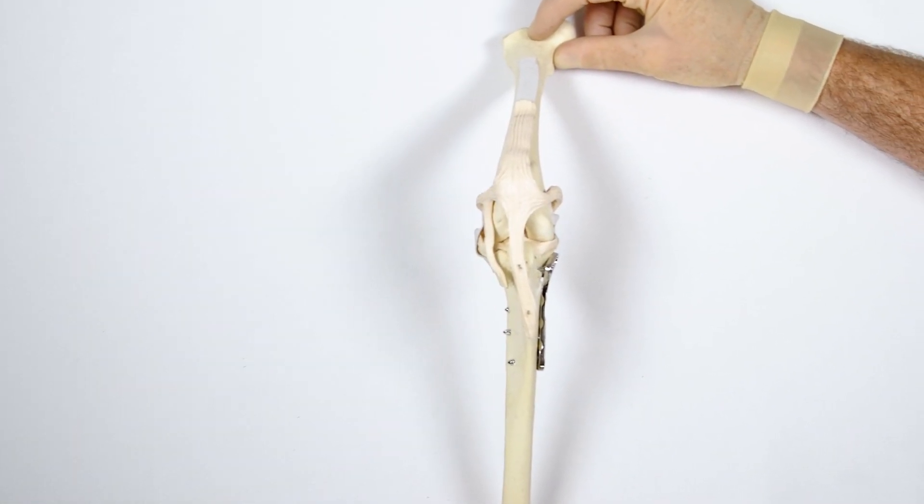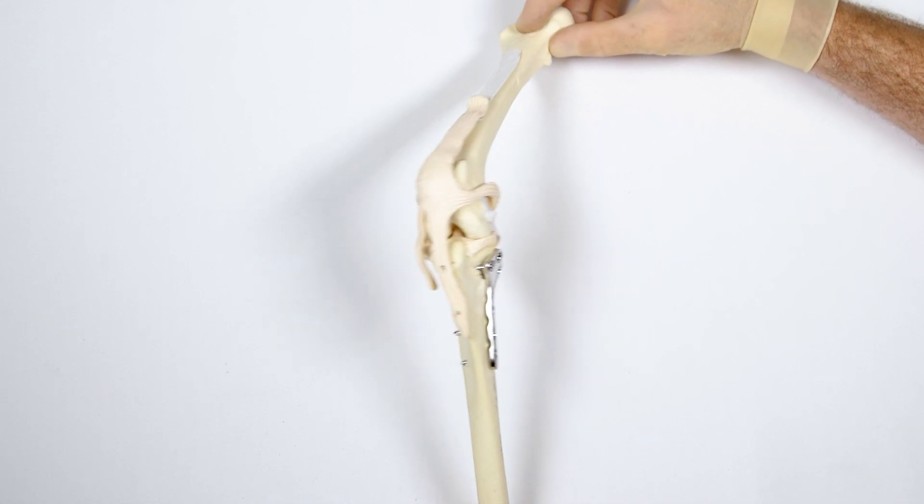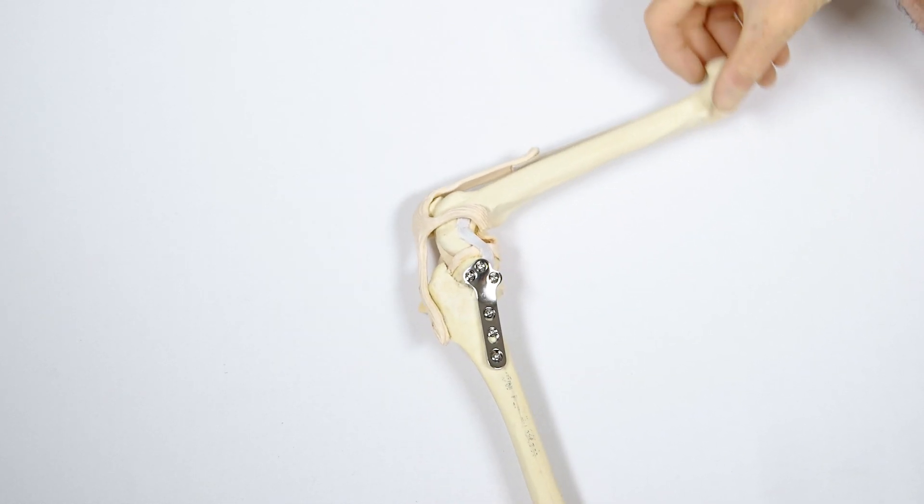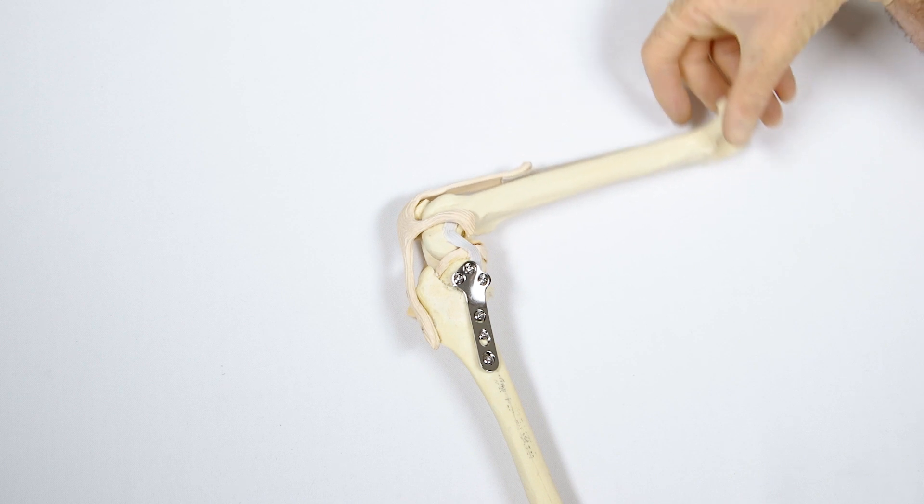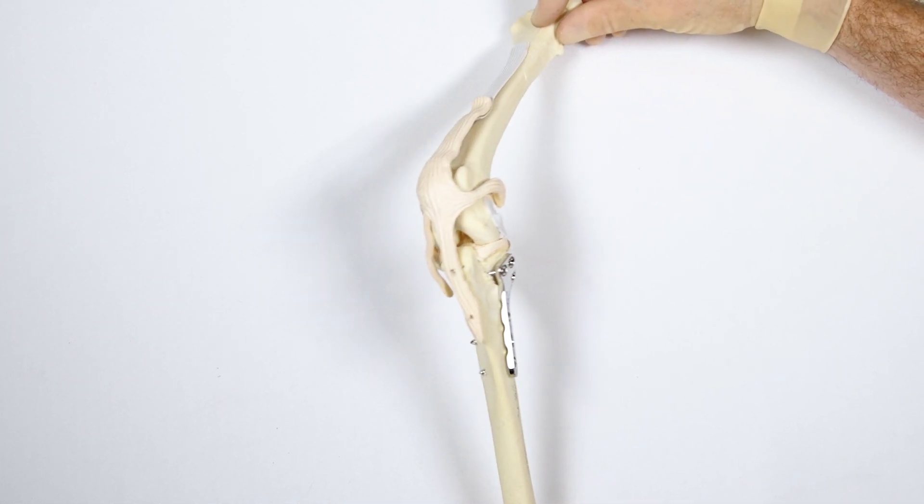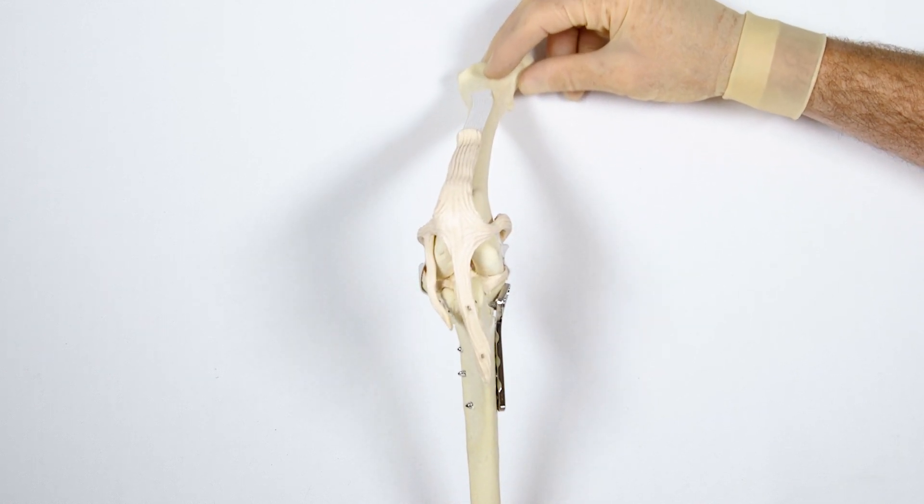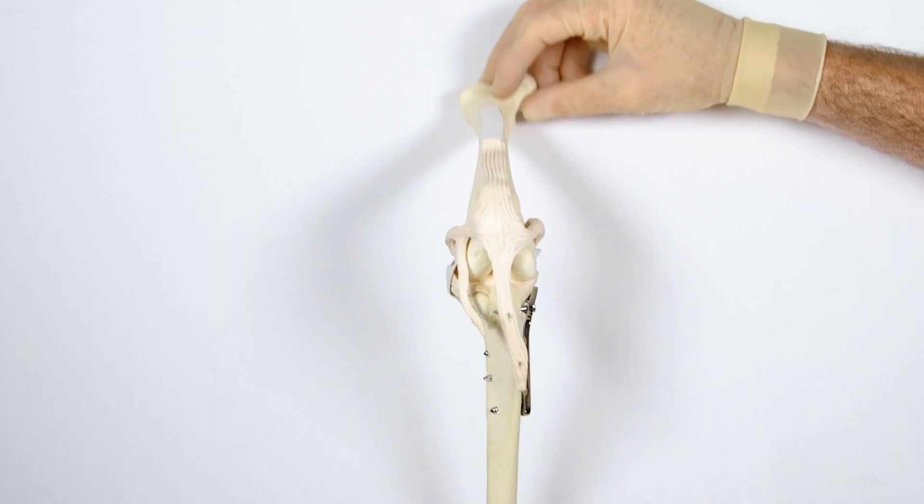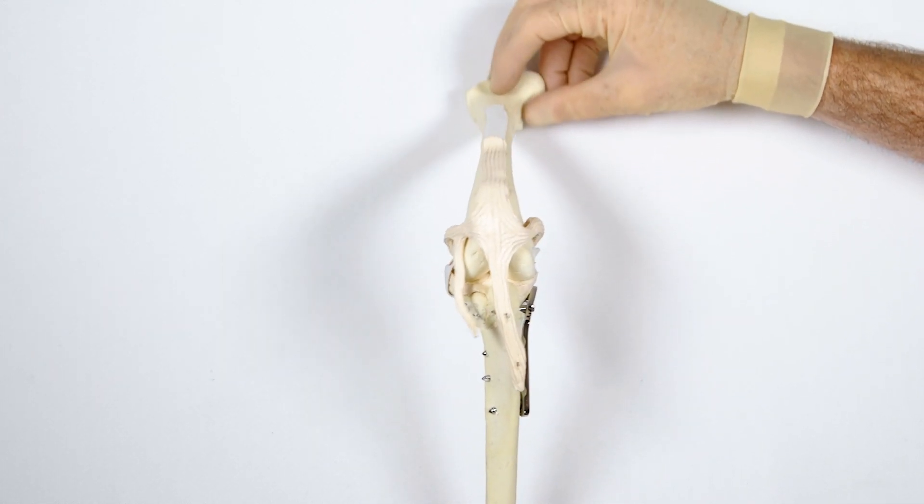Following plate placement, limb alignment, range of joint motion and patellar tracking must all be checked prior to closure of the joint capsule and routine surgical closure. Cranial tibial thrust should be negative but cranial draw will still be positive.